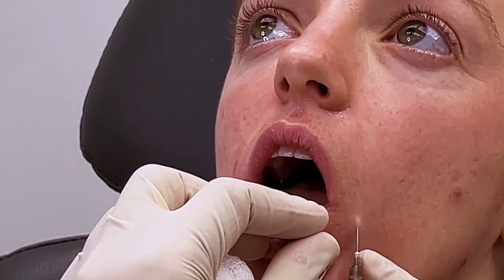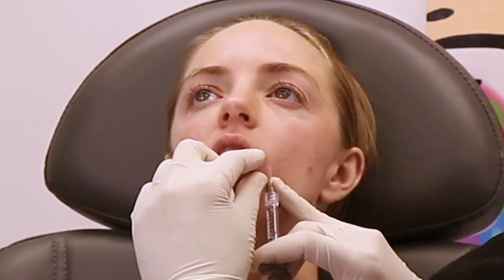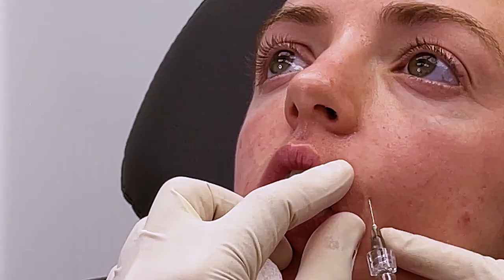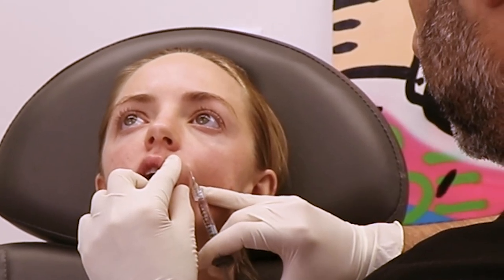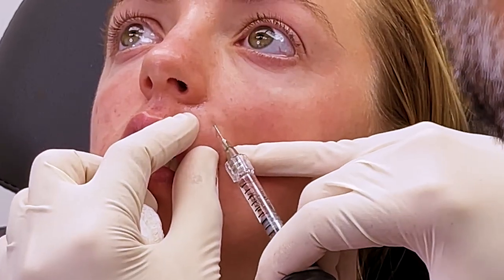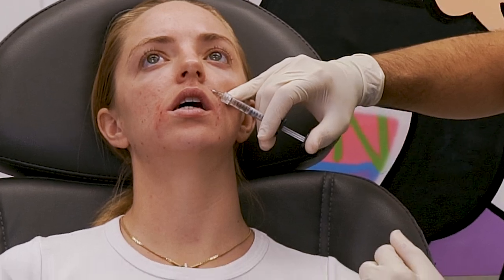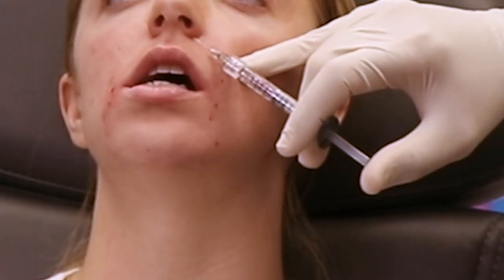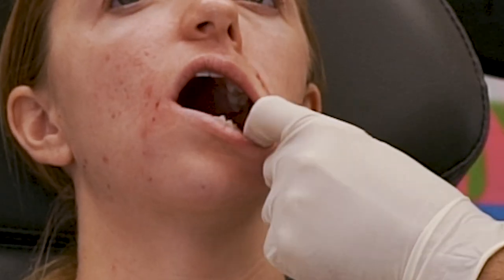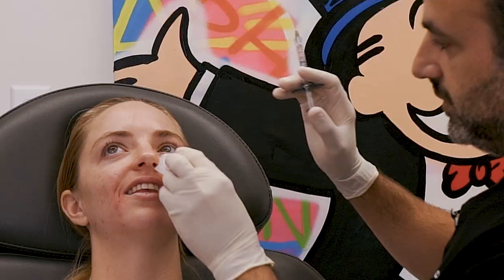That's a little trick you can use for people who have lines around the marionettes where it follows all the way into the sulcus. There's another line that forms on people that comes down into the pre-jowl fold — I inject those with the patient smiling, and this is all retrograde. This is a very safe plane to be in, directly subdermal or intradermal. You do not want to get into the muscle plane accidentally. And here you never let your needle hit the alar crease — if you want to do here, inject as you go in and stop.